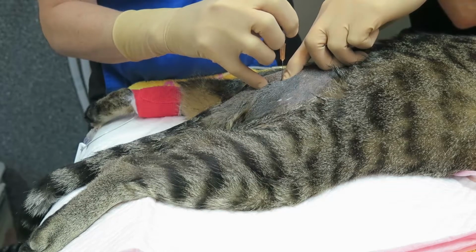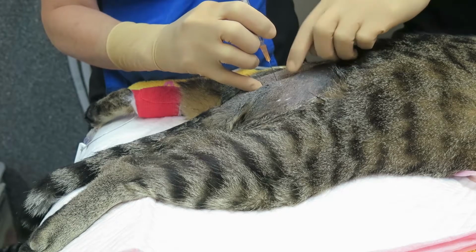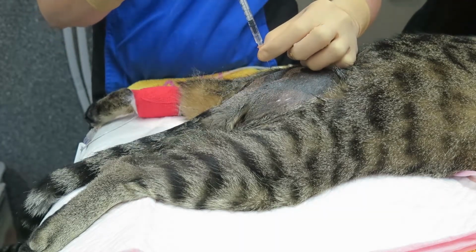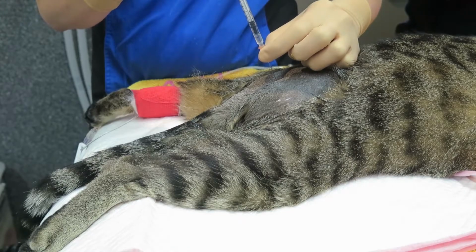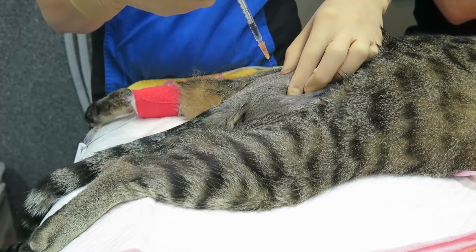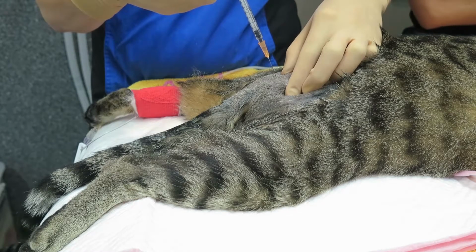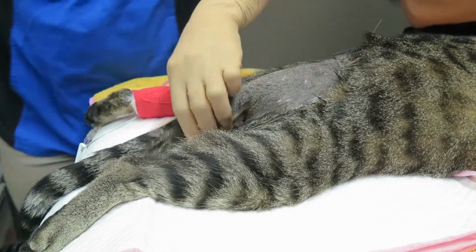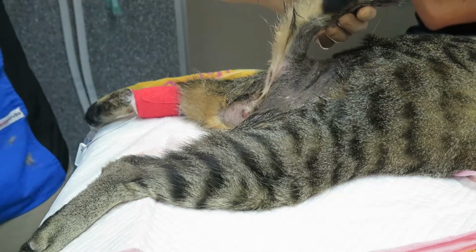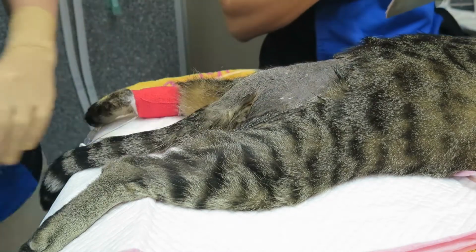So as you can see, we've located our most mobile joint, and then we're introducing the needle perpendicular to the spine at about a 30 to 45 degree angle. You advance the needle through the ligamentum flavum, so you'll feel a little pop as that happens. If you hit bone, then you can just walk the needle forward and backward, as you can see in the video. Once you feel you're in the right location, then aspirate backward, and if you're happy that there's no air or blood, then you can slowly inject it in.